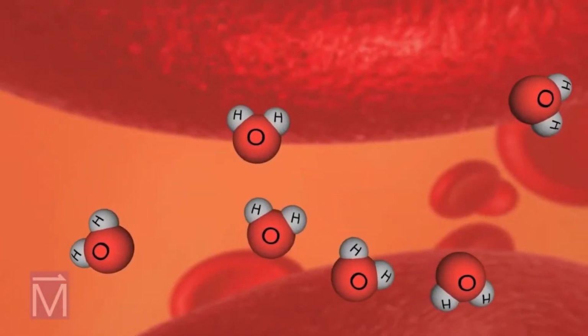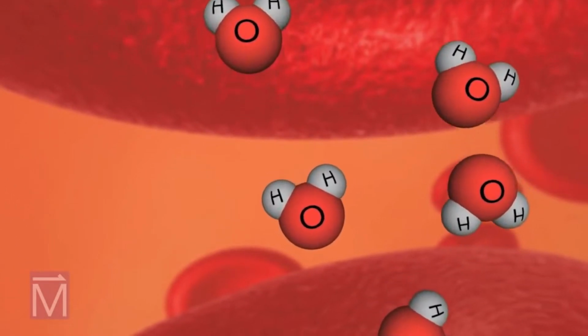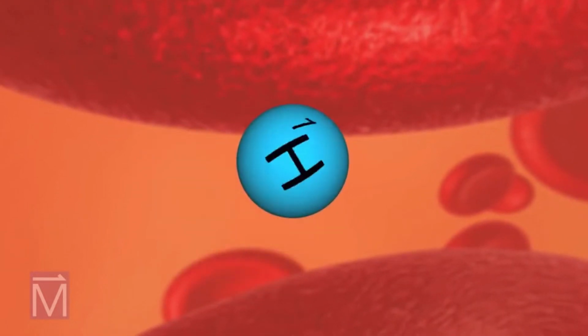The human body is made up mostly of water molecules, or H2O. So it contains lots of hydrogen atoms. These atoms react in a very useful way to an MRI's main magnetic field and the radio waves it emits.